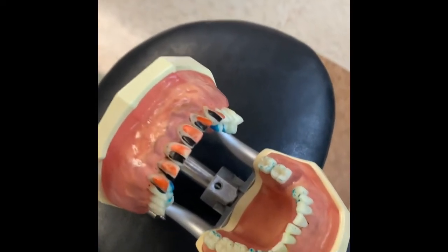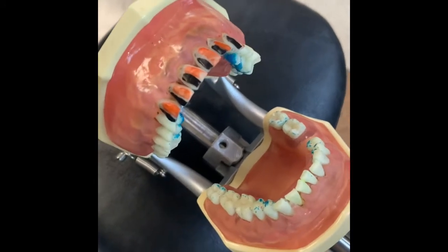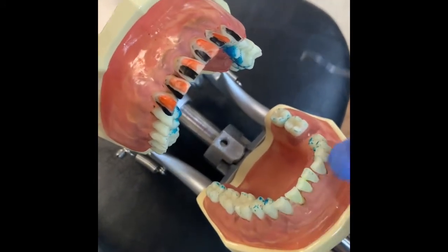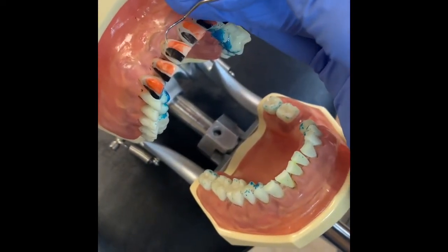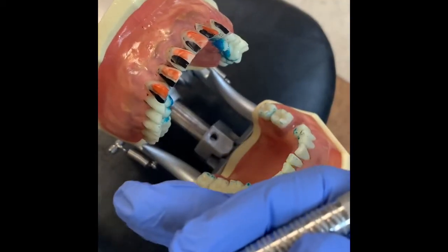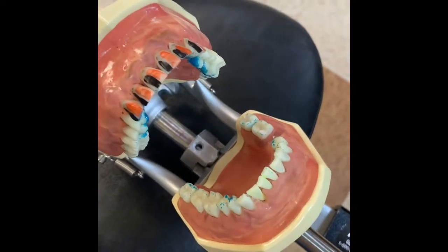Now we are going to work on exploring anteriors. Remember, with your anterior teeth, you have surfaces towards you and surfaces away. But when we determine surfaces towards and surfaces away with the anterior teeth, we split the tooth in half. So I'm talking about a right-handed clinician in this video. Left-handed clinicians, exactly the same, but on the other side, okay?